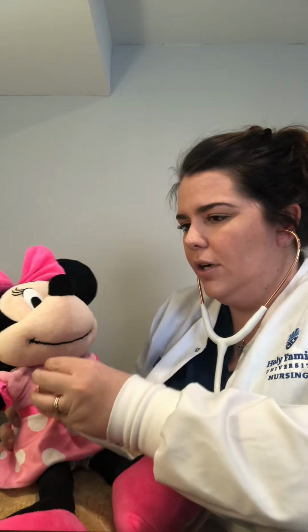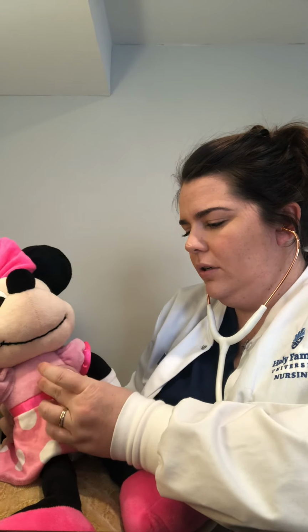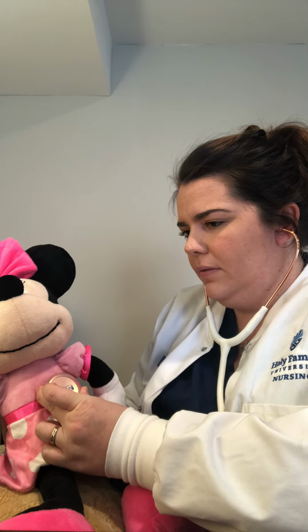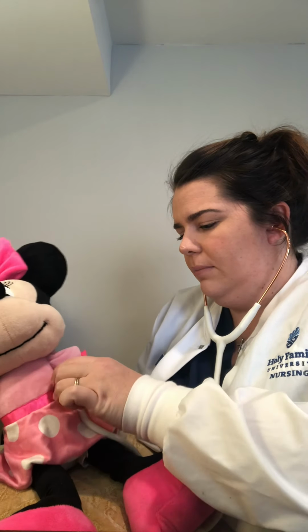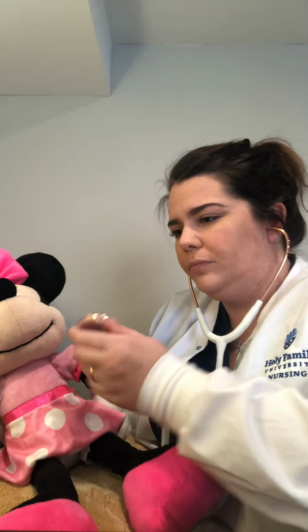Okay. Now I'm going to listen to her heart sounds with the bell. So once again, aortic, pulmonic, Erb's, tricuspid, and then the mitral, which we would do that one for a minute, mitral apical as well.